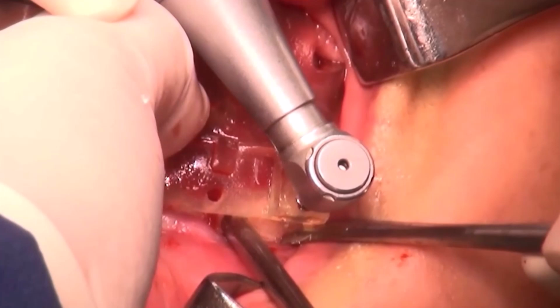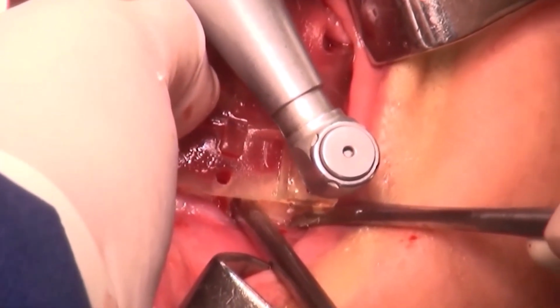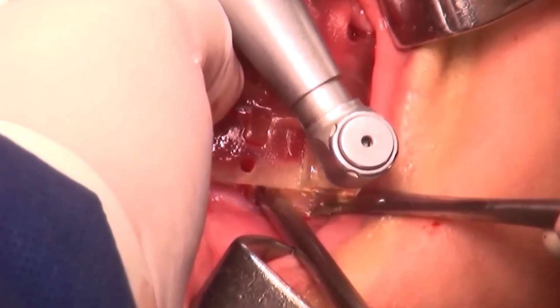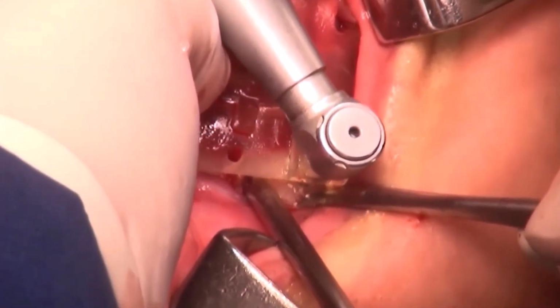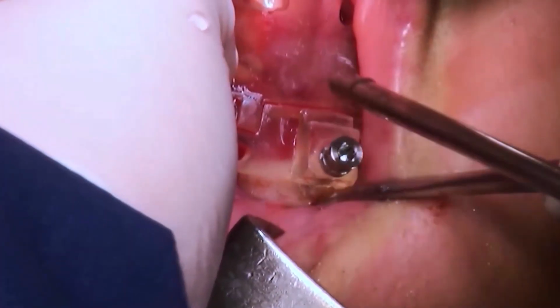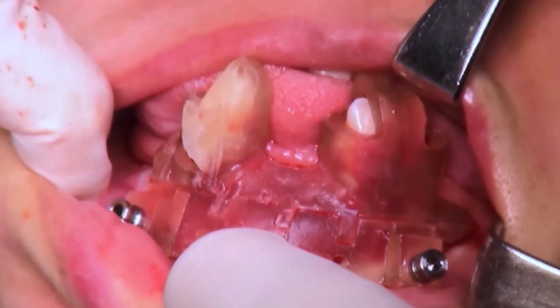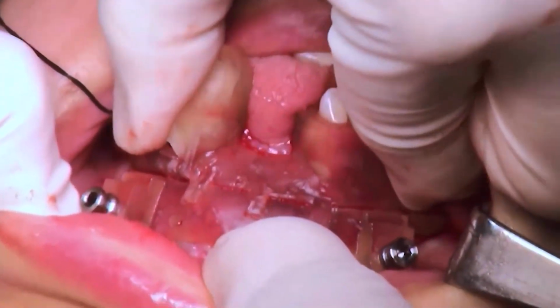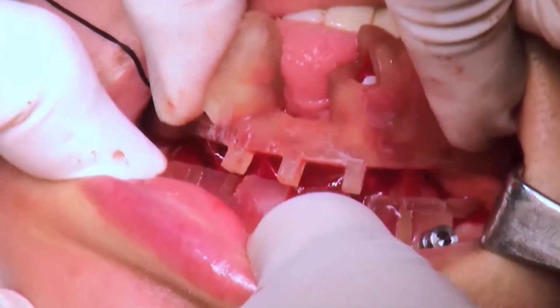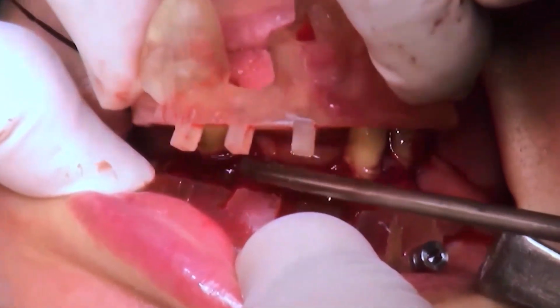You can see here low-speed drilling without irrigation. The speed is 100 RPM. The second anchor screw to fix the foundation part. The top part is removed by pulling it out.